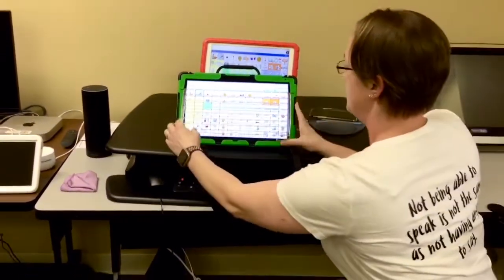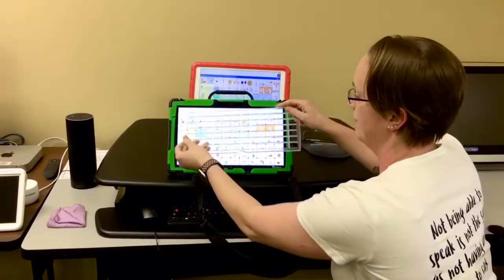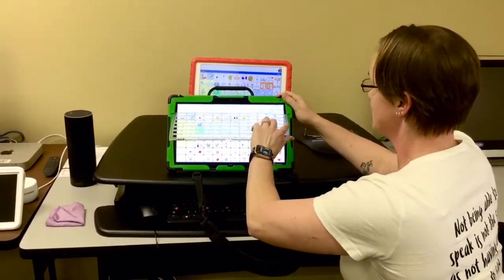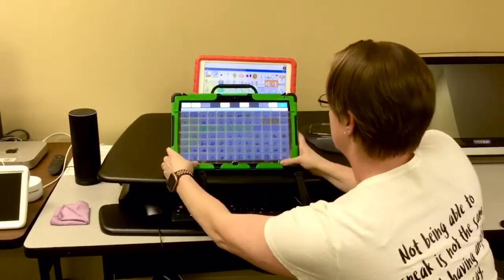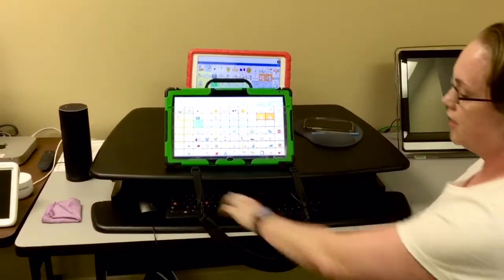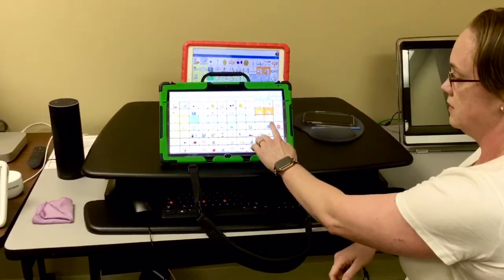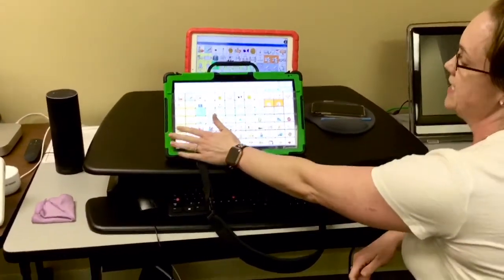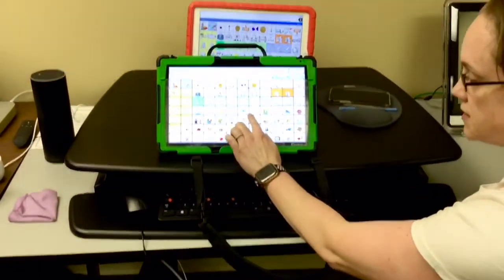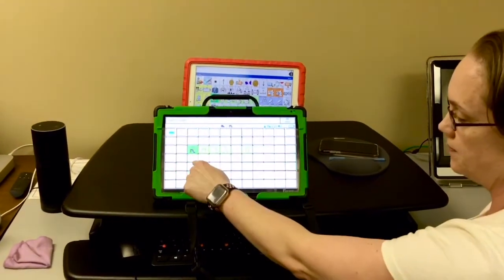Whoops. Oh, that's because I have it on backwards. Even professionals make mistakes. So now if I'm going from don't, slide, I can't hit anything wrong because this hole is cut out and I have to really put a finger in there. Slide.